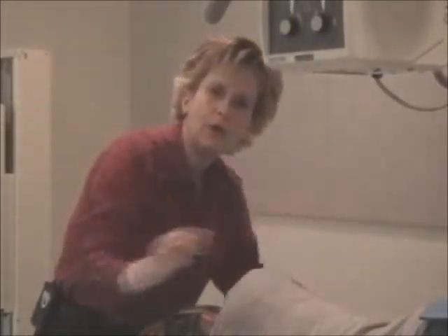Now, obese patients, you're going to have a lot of tissue out here, and you need to keep in mind that a patient might be large, but they could be firm. Organs are going to tend to be held in place. If a patient is large and not firm, the stomach will tend to fall more forward. So what we're giving you are not precise positioning reference marks, they're guidelines. And you must think of patient habitus and think of patient condition and adjust accordingly. That's one of the pleasures of our jobs, because we're not button pushers. We do have to think through this.